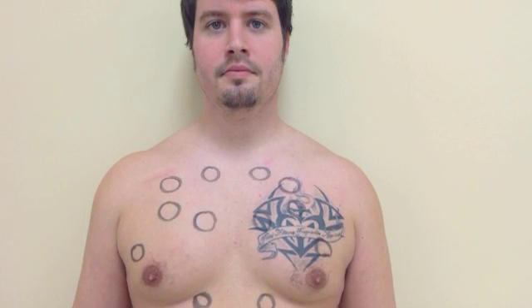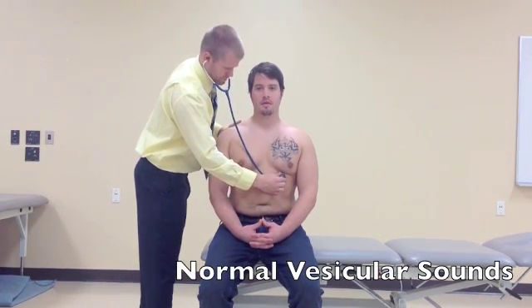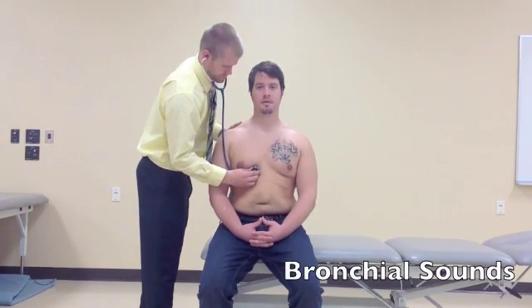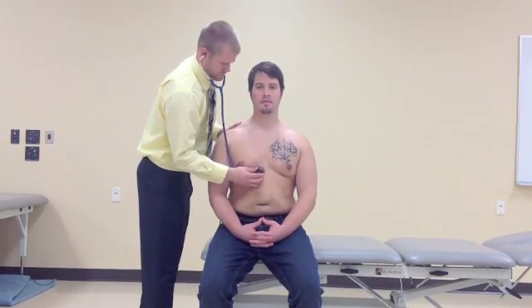Possible places for chest auscultation for the anterior lungs are shown here. Avoid the ribs and sternum, listening to the intercostal spaces. Three spaces should be listened to going from side to side to compare, listening for one complete respiratory cycle. Here is a normal vesicular sound, followed by an abnormal bronchial sound, and a normal bronchovesicular sound.